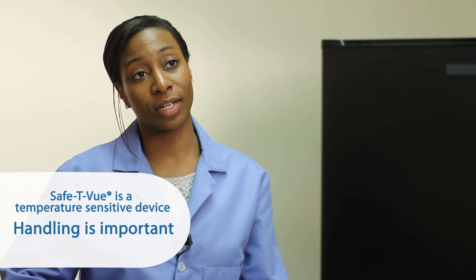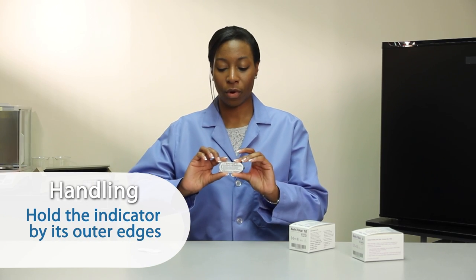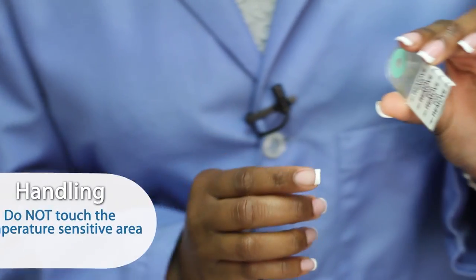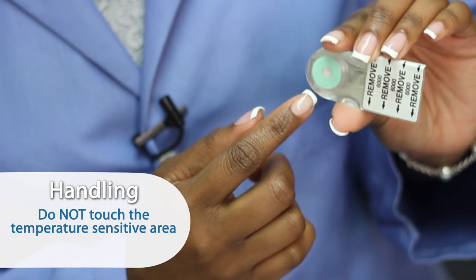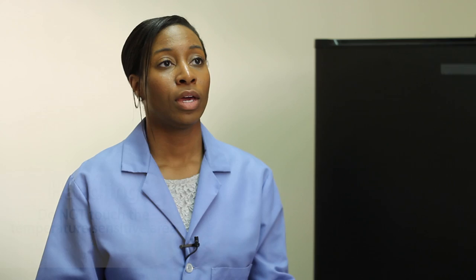Because the safety view is a temperature-sensitive device, handling is important. Hold the indicator by its outer edges. Do not hold or touch the temperature-sensitive area, since your hands can pre-warm the indicator and affect its accuracy.